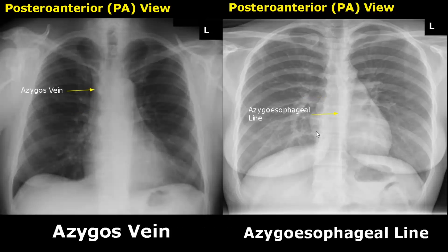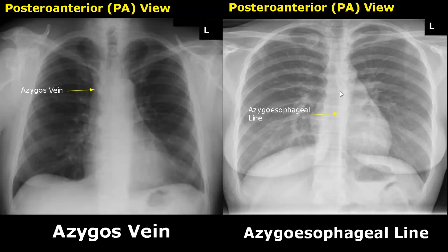This small knob is the azygous vein. It is usually on the opposite side of the aortic knob. The azygoesophageal line is found by the interface of the right lower lobe, the azygous vein, and the esophagus. It is also called the azygoesophageal recess.